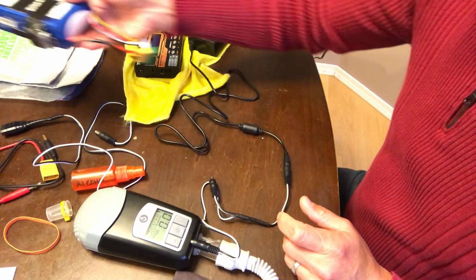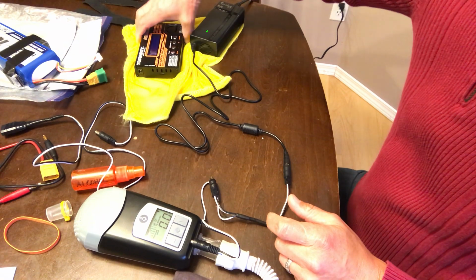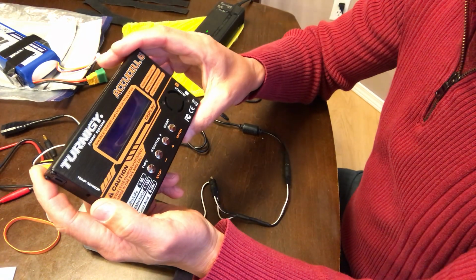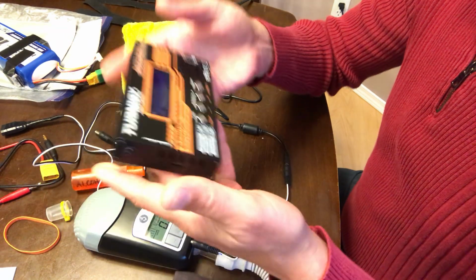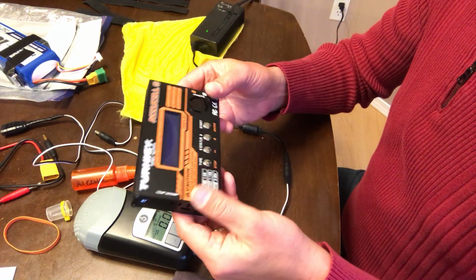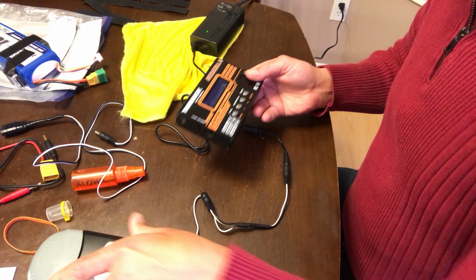So that's the battery. Now if you want to charge that battery, you need a Lipo charger. I just happen to have this AccuCell 6 from some old RC stuff as well. It's pretty lightweight for as powerful as this little sucker is, and it allowed me to charge it.